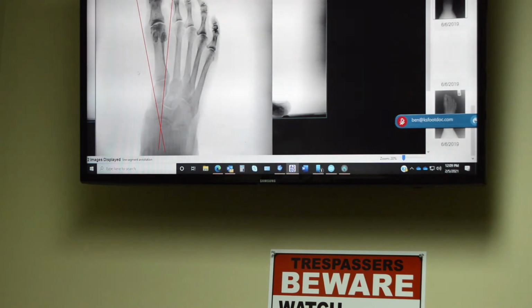This is the area that changes or collapses to cause foot pain. It puts a strain on that plantar fascial band that we're looking at in the ultrasound. Basically, it's straining that area, and with that strain causes the itis or the pain or inflammation to the plantar fascial band. Now, when you come see me, these are going to be the two main tests that we're going to do. It's going to be an x-ray and ultrasound to examine your foot pain.